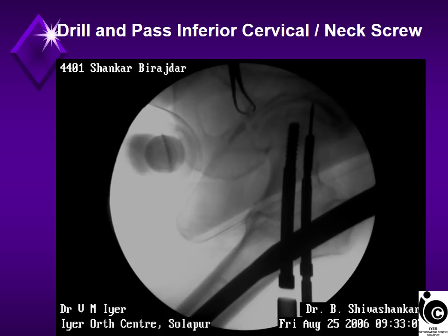Here you can see the inferior bolt also has been passed. Once you pass both of them, see that you have released the traction, and alternately compress both the superior derotational bolt as well as the inferior cervical screw so that the fracture gets compacted.